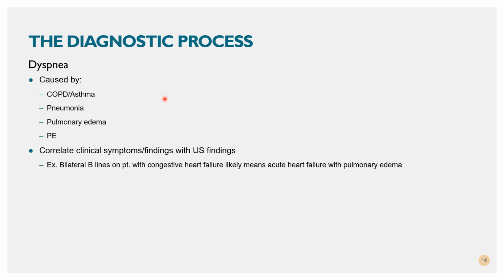Okay, so the diagnostic process. Your job is not easy at all, but we know that dyspnea is going to be caused by a number of different things. And we know that providing point-of-care support can actually help lead you in one direction or another of what could be causing that dyspnea. But obviously you're going to have to take the point-of-care ultrasound findings and consolidate those with your clinical findings and patient history. So we know that dyspnea can be caused by COPD or asthma. It can be caused by pneumonia, pulmonary edema, or PE.